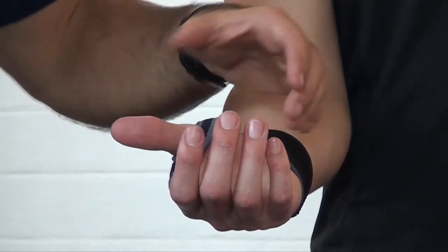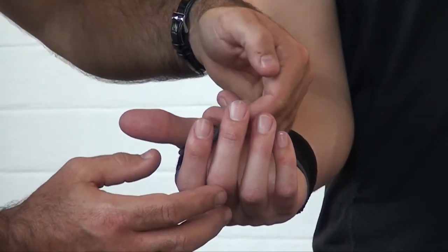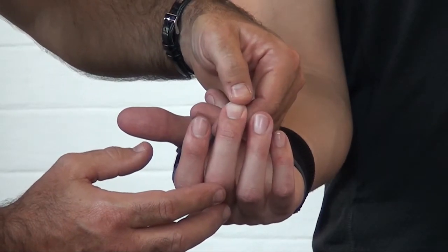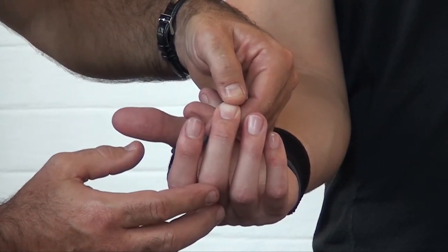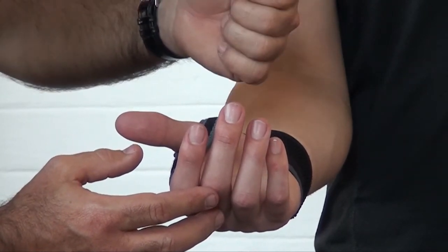With all wrist braces or braces that go around the wrist, to test, make sure that they're not too tight. You can test the capillary refill by pressing down on the thumbnail — that goes blanche as white — and releasing. The colour should come back within a second or two to make sure that there's decent blood supply.